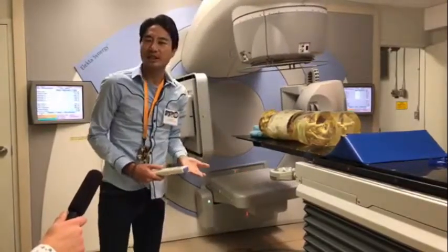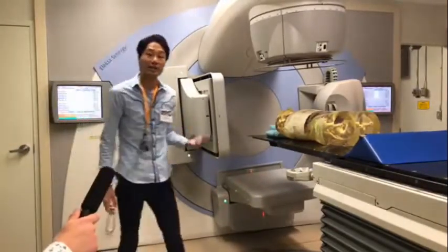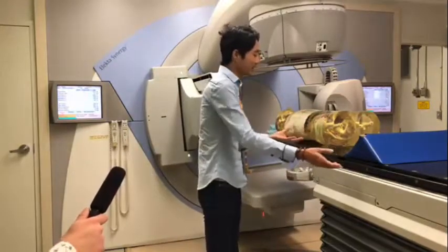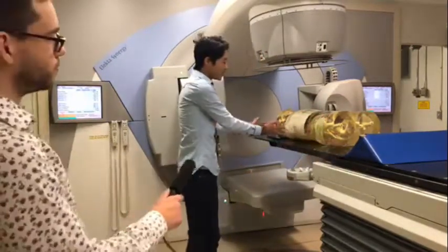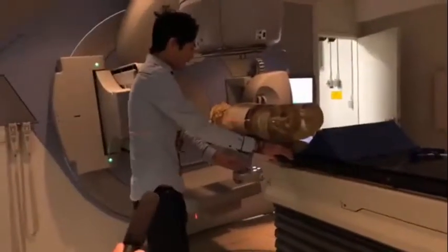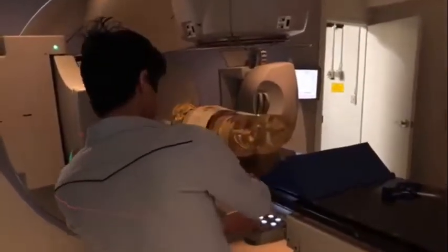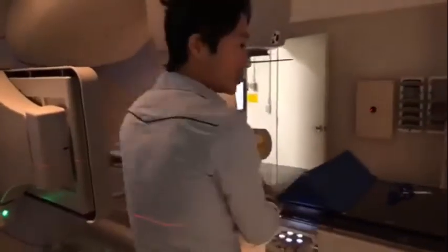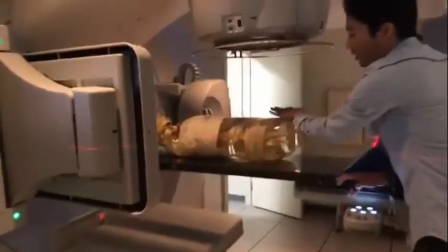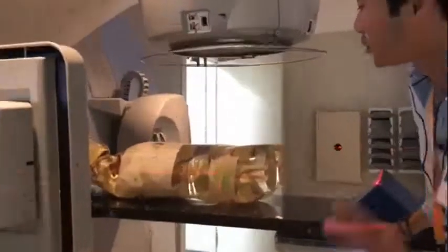About what radiation therapy is, basically it's the use of ionizing radiation to treat cancer patients. So if a patient had, let's say, prostate cancer, our job would basically be setting them up into exactly where they need to be. So for example, I can turn off the lights and I can line up the lasers. It might be a little hard to see. And once we get them in the right position, we can basically treat the target by the gantry rotating in multiple directions. So it's pretty cool. It's a very targeted treatment.